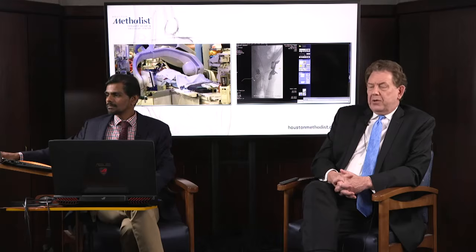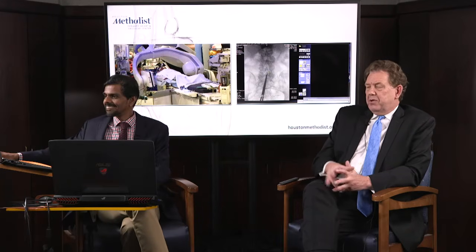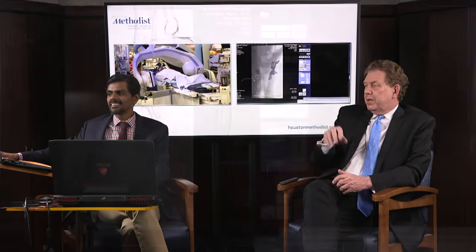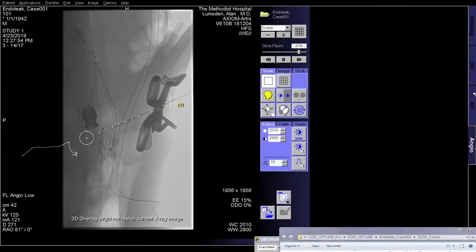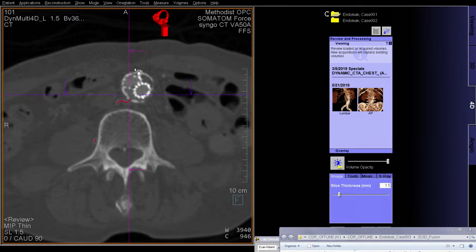That retractor thing is because we couldn't tell where the colon was. So we thought it was safer just to make a little incision and spread, because the aneurysm is so close to the anterior abdominal wall, but it's kind of a bad day if you stick a needle through the colon and then into the aneurysm sac.